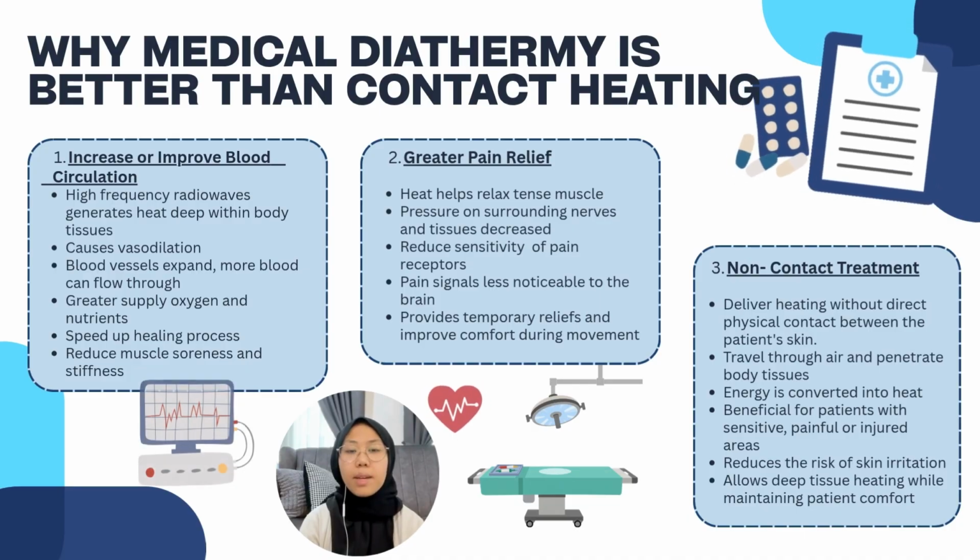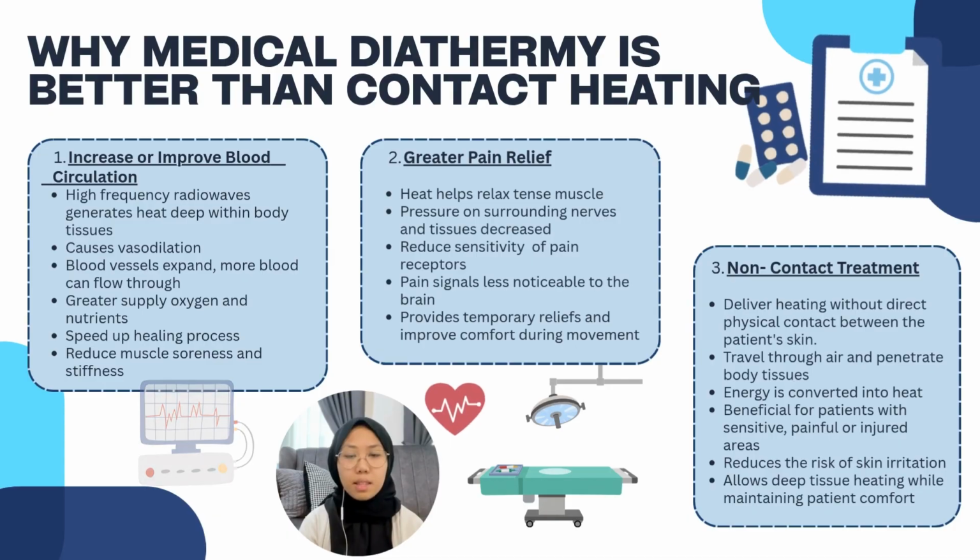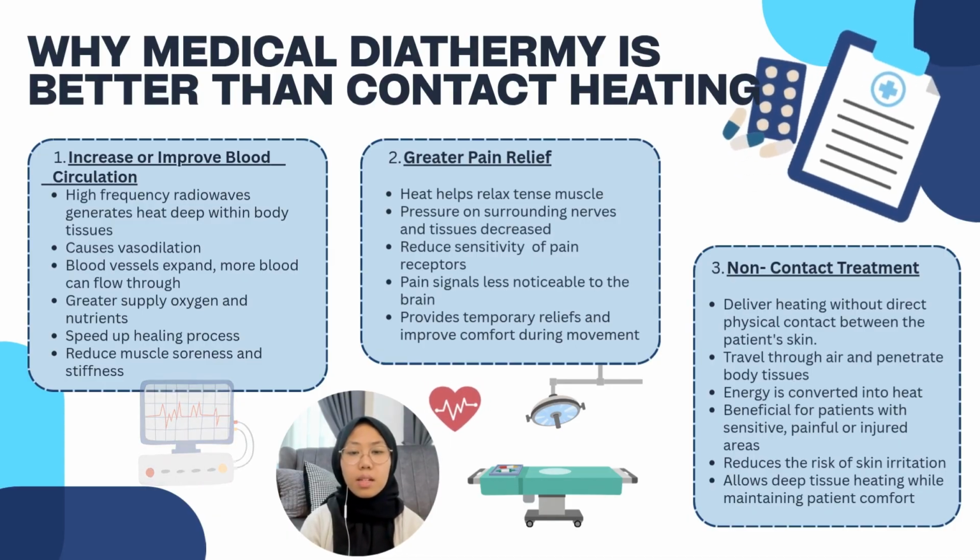So, in conclusion, medical diathermy is more effective than contact heating because it will improve blood circulation, provide better pain relief, and offer a comfortable non-contact treatment method.